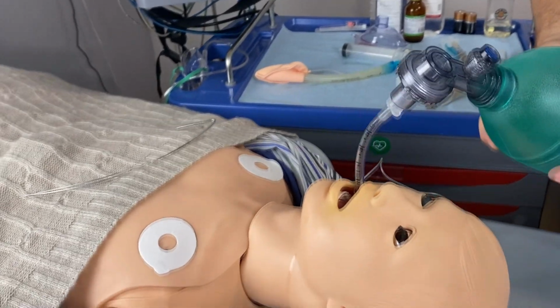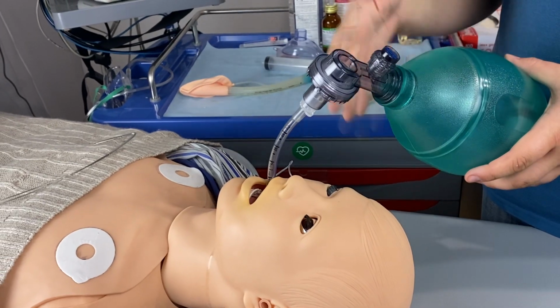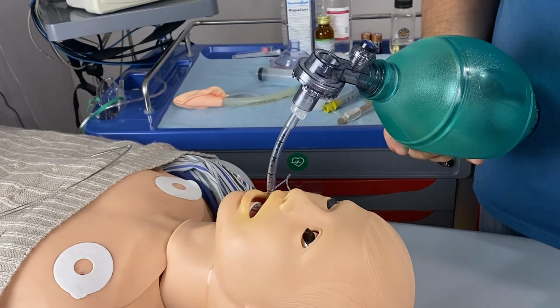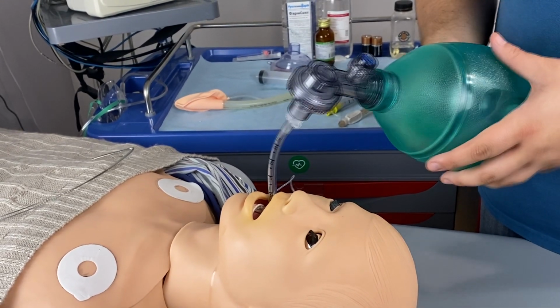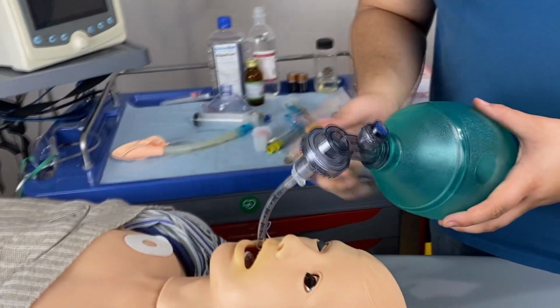And then we keep ventilating the patient, and if everything is normal, then the saturation will go up, so the respiratory function will be compensated. We can ventilate the patient manually with the bag, or we can ventilate him using the artificial ventilation machine.